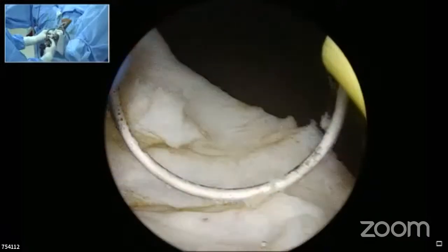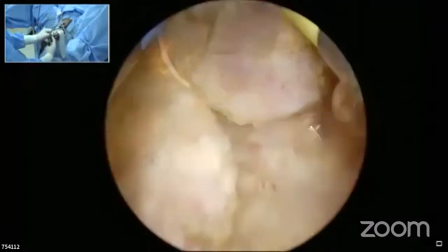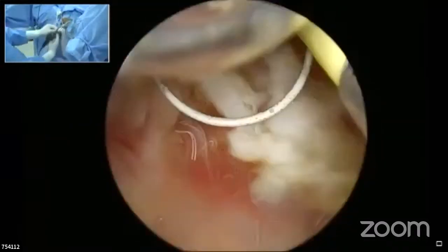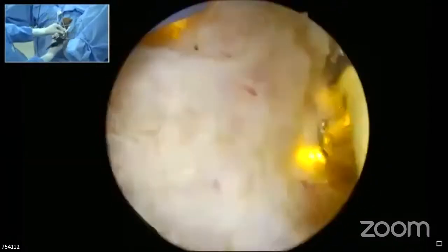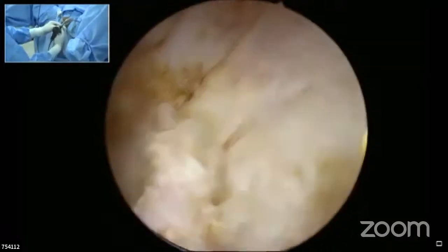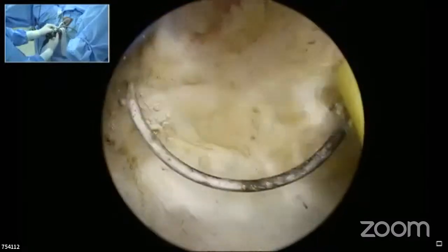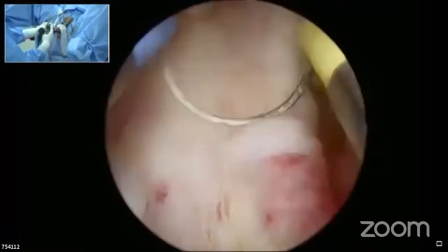But we have not got a comparison between the two. We have a comparison between a regular bipolar TURP and enucleation, which we have published already. No, but why not popularize this thing, what he's doing? That is my saying actually. So this is mostly what the majority of the time we do, because today morning we just did it for a learning purpose, a standard technique is always better. No, with this technique, most of the urologists, practicing urologists, would like to do this instead of enucleation to begin with. Yeah, of course, sir.